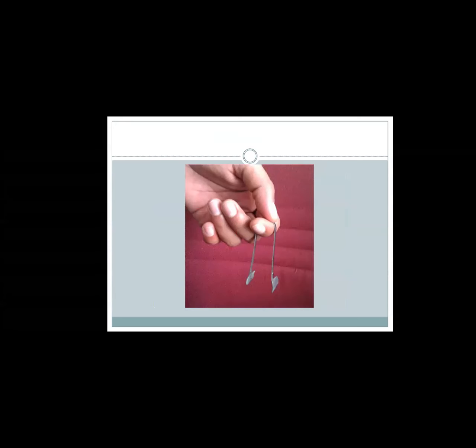The lower 2 blades are facing away from you, and facing the patient. So you have to hold it suspended on the index finger, with the blades facing the patient. Then close it with the middle finger and the index finger for retraction, and that will give a proper visualization of the nasal structures.